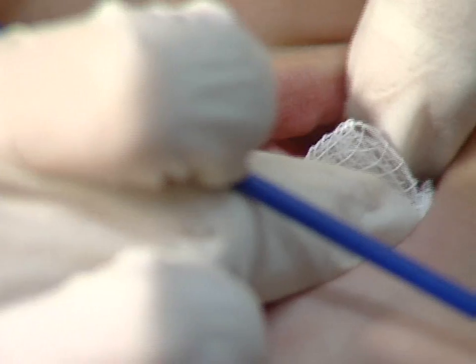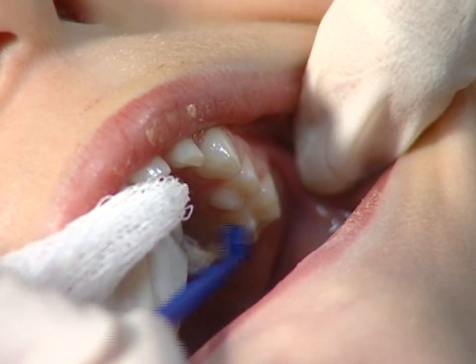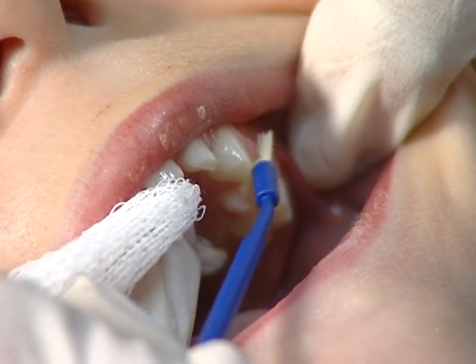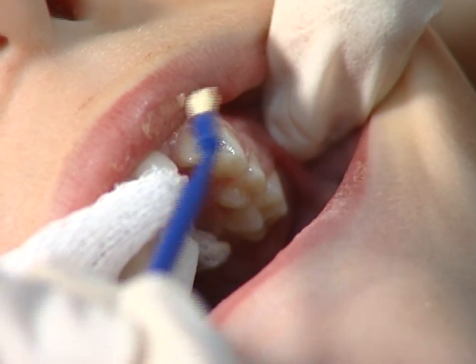Older children have more teeth, and you will have to start by applying the fluoride varnish to the back teeth. Dry the teeth in the upper left corner of the mouth with the gauze and paint on the fluoride varnish. Be careful to hold the tongue and cheeks out of the way. In this case, we're using enamel pro varnish.